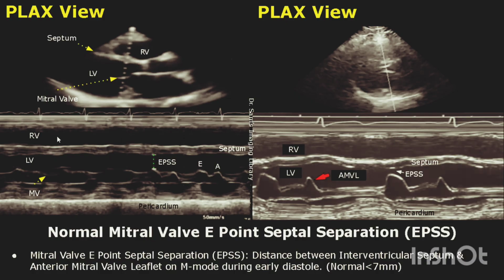The anterior structures or the upper part of the image is seen at the top. So the skin is seen at the top. Then we will see the right ventricle. This is the septum, and below the septum is the left ventricle. These waves are the mitral valve leaflets. Mainly, we will see two waves throughout the cardiac cycle on M mode.